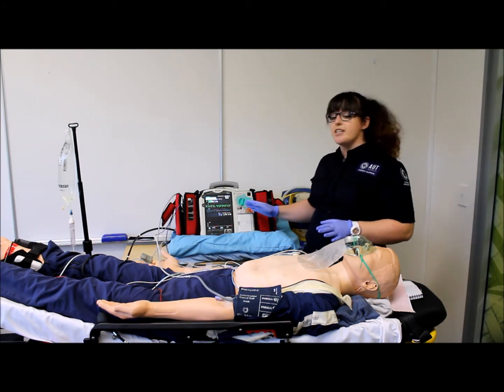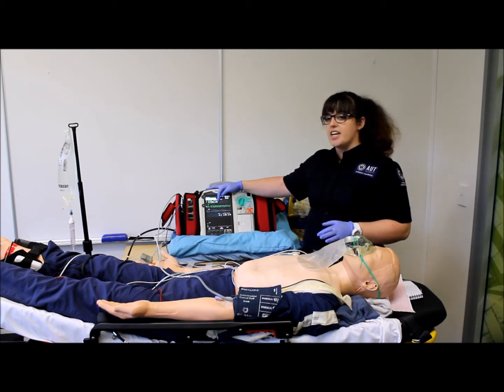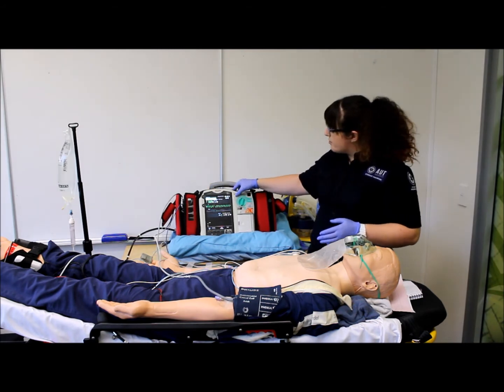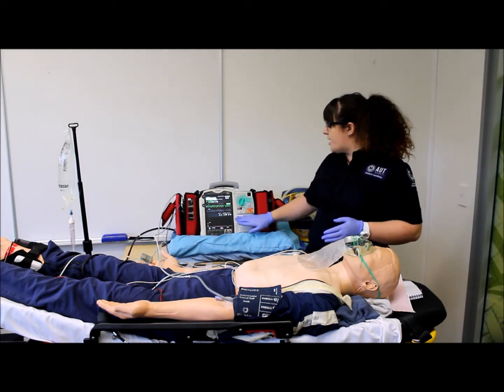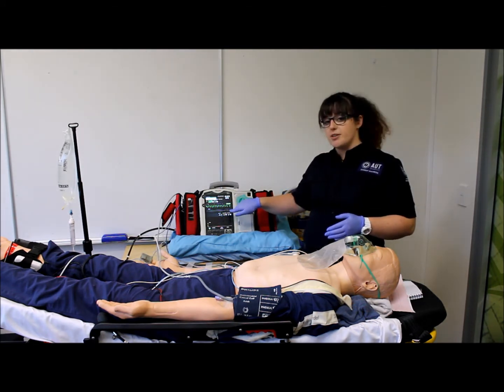We are currently in manual mode. We have selected lead 2 as it has the most visible R wave and there is no artifact shown. We are now going to press sync to put our monitor into synchronized mode, and we can see a detection symbol over every QRS.